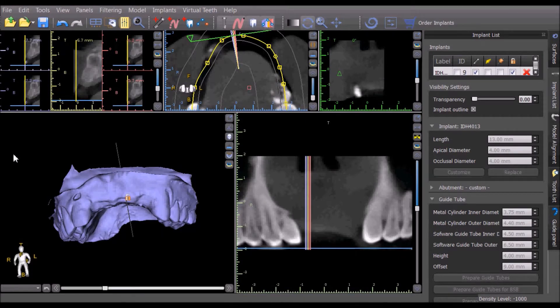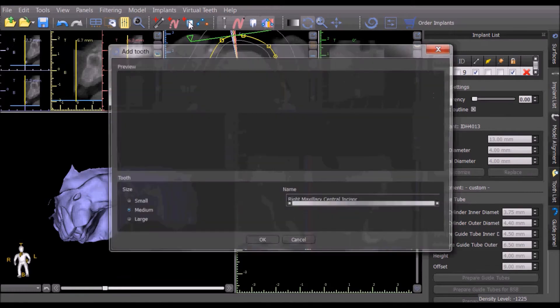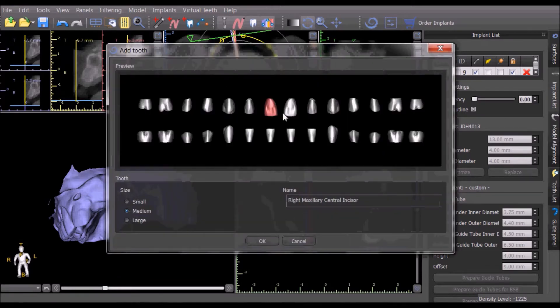A virtual tooth can be added by selecting the Add Tooth button. Select the relevant tooth and the general size and press OK.